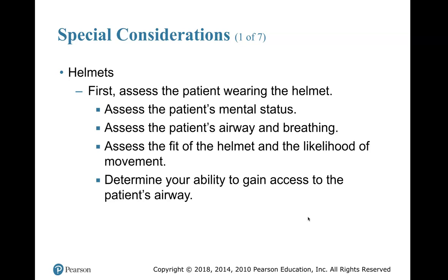All right, helmets. Because as EMTs, we are going to probably work some football games and such. Or we might even have to deal with a motorcycle crash here and there. All right, first assess the patient wearing the helmet. Assess the patient's mental status. Assess the patient's airway and breathing. Assess the fit of the helmet and the likelihood of movement. Determine your ability to gain access to the patient's airway.